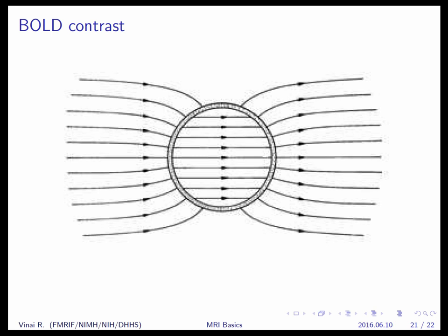Okay. Are people appreciating that? Yes? Sorry, I'm not sure I exactly understand what you mean by background stuff going on. So you can see the spacing of the magnetic field lines in the blood vessel. Here, they're fairly dense, and they're denser than they are out here. So the lines here are further apart. So it means schematically, diagrammatically, that the magnetic field in the blood vessel is higher than it is out here in the peripheral tissue. And that difference in the field from here to here is actually what we term a background gradient in the tissue.